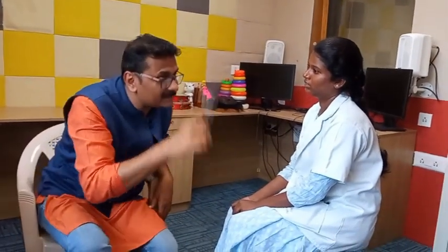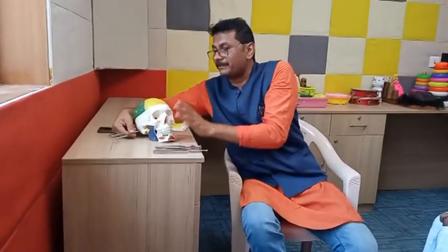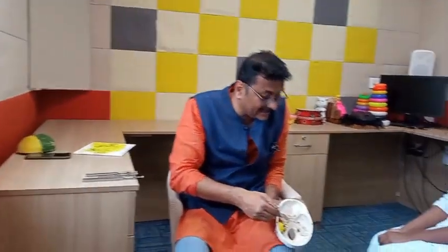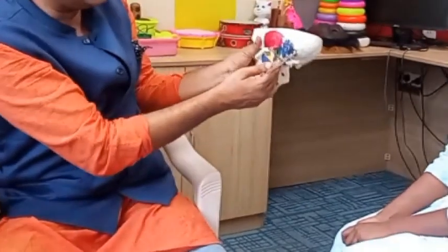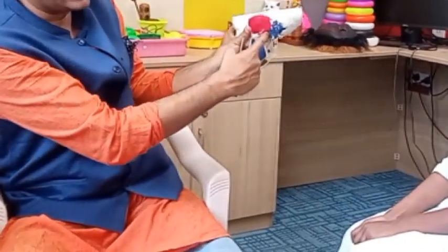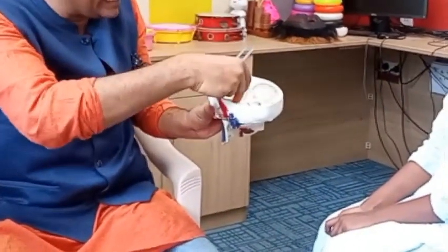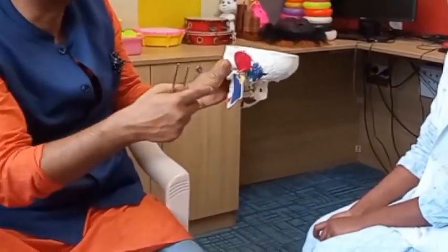Why does it increase? This is the reason. I hit the tuning fork — this is her skull, I place it on the mastoid. What happens? The entire skull, eight bones, they start vibrating. As they start vibrating, the sound naturally enters in and vibrates everything. Our inner ear is inside the petrous part of the temporal bone. The blue colour is the temporal bone. The petrous part of the temporal bone is here. You have the cochlea here, the middle ear here, and the external ear in green. As I place the vibrations here, the entire part gets vibrated and a part of the vibrations start coming out of the ear. There is an outflow.